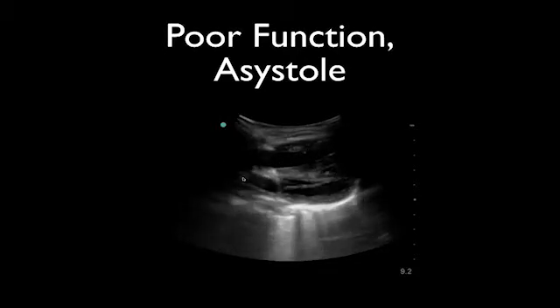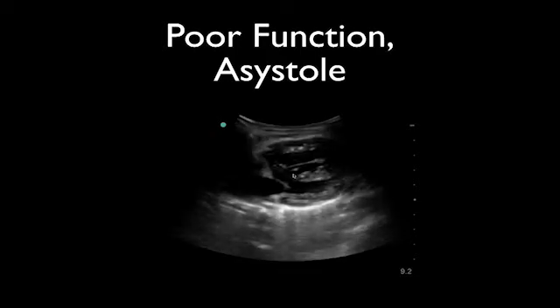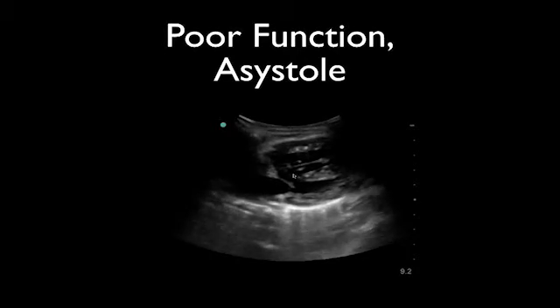Left ventricle is over here. But really, anytime you see dots of blood, any kind of bubbles, that means that there's stasis of the blood, and that's really bad. So not a good prognosis for that one.